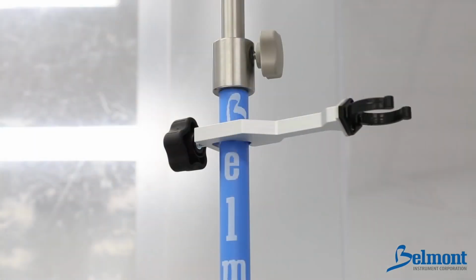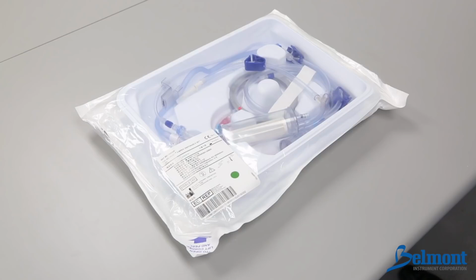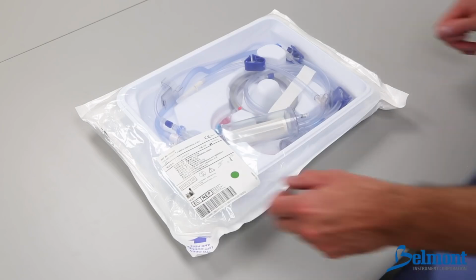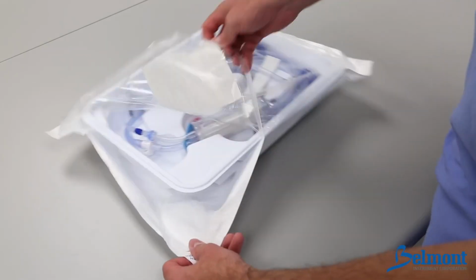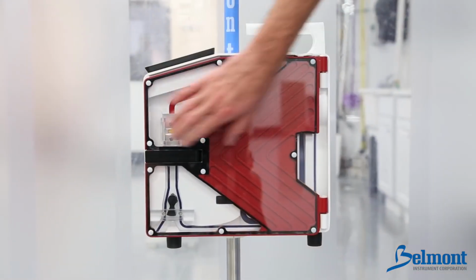Install the small reservoir support approximately 9 inches above the top of the system. The single patient use disposable comes pre-assembled in a sterile container and is color-coded for easy installation. Begin by opening the disposable package and tightening the two luer locks. Open the door of the unit.